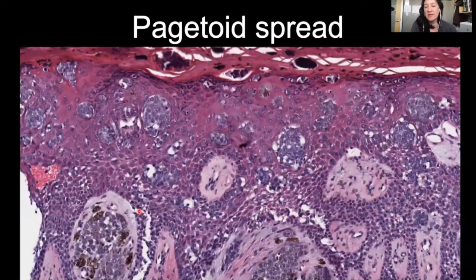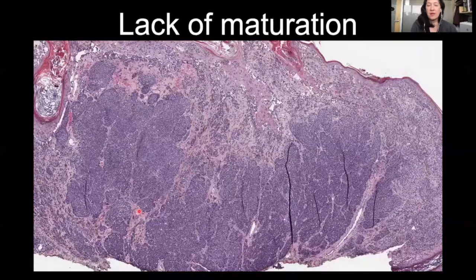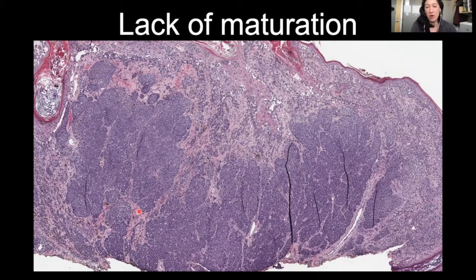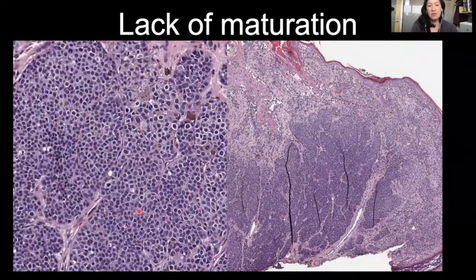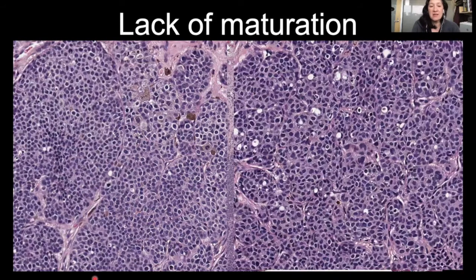Pagetoid spread is upward extension of single cells or nests of melanocytes above the dermal-epidermal junction. Generally, the higher they go, the more worrisome, with some exceptions. Lack of maturation — this is an example of a nevoid melanoma. You can see there are large atypical nests that extend and span the breadth of this lesion. Looking at the cytology at the top of the lesion, these melanocytes are large, plump, epithelioid, and at the base they're almost indistinguishable — so the melanocytes are not getting smaller with increasing dermal depth.